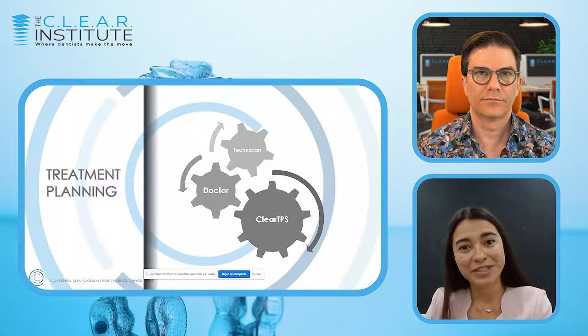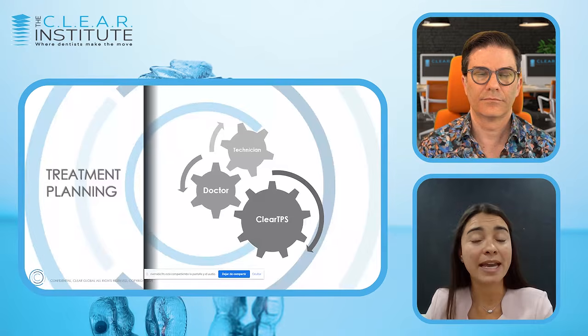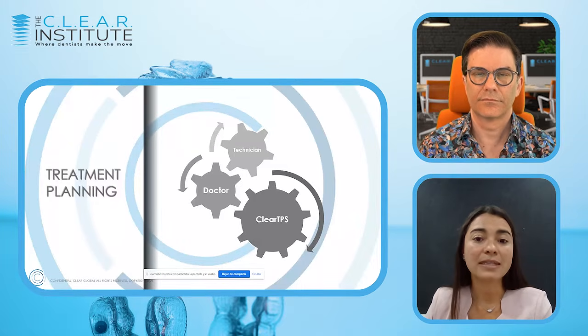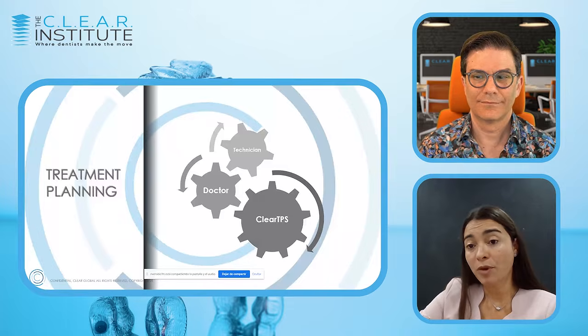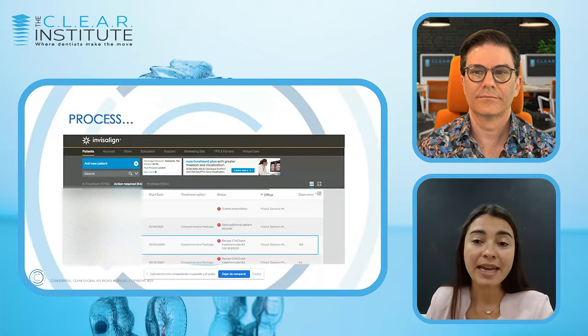Then the doctor, of course, is the one that begins the process and knows the patient. And hopefully what we try to do at ClearTPS is take away the majority of the time of this process, the majority of the clinical decisions and clinical evaluation of the case away from the hands of the doctor, so the doctor can use his time better and only do a final checkup on the case. So the process that you will go through when doing a case is very simple.